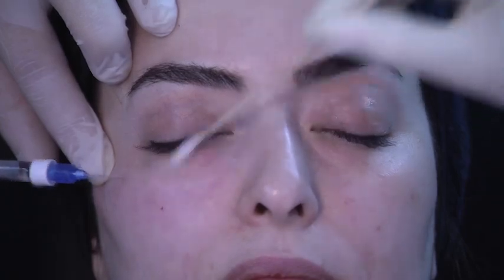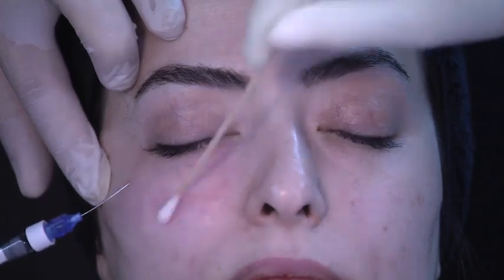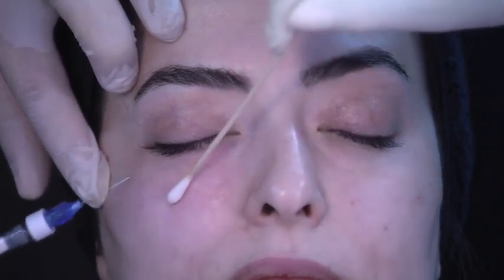Right. So I'm doing exactly the same. I wait for the bleeding to see the entry point. Now I get in and I go through the ligament. There is a little resistance here, but I'm still under the muscle. So if I do like this, I don't see my cannula. Right. So when I have a very deep palpebromalar groove, this is also another opportunity to do this treatment.